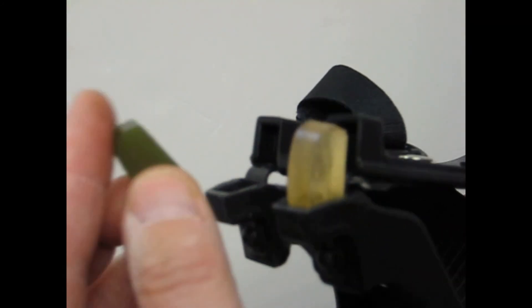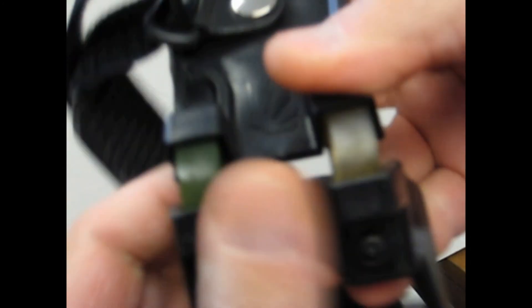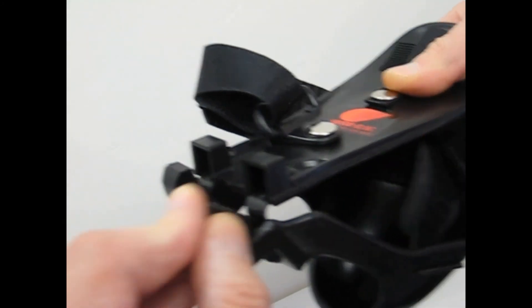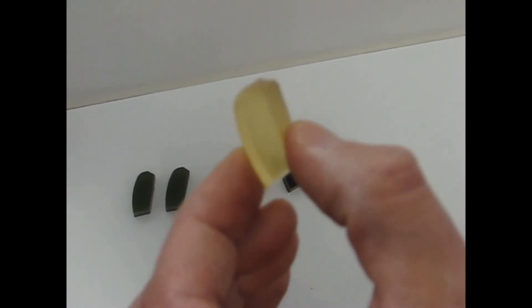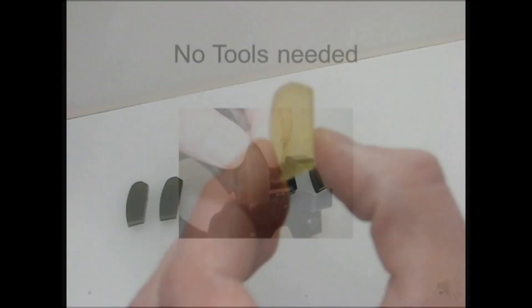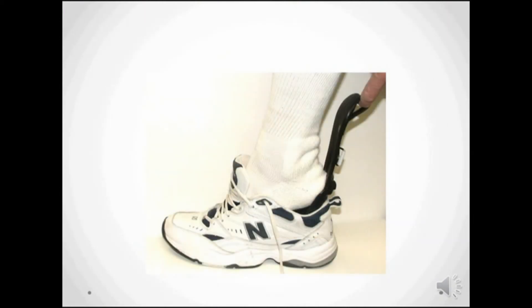The Jacob joint is the only joint that allows the patient to dial in the right amount of shock absorption to meet their personal needs. This is done with interchangeable bumpers, of which several durometers come with each brace. No tools are needed.